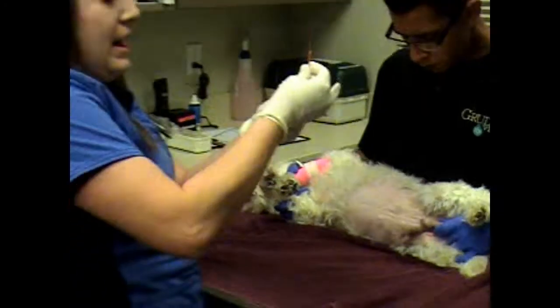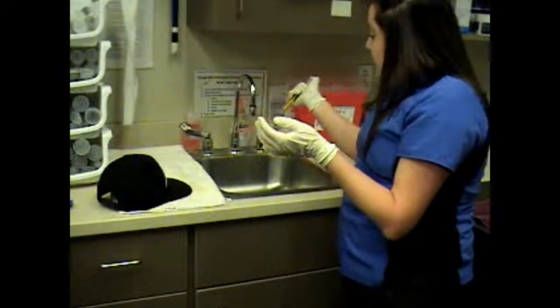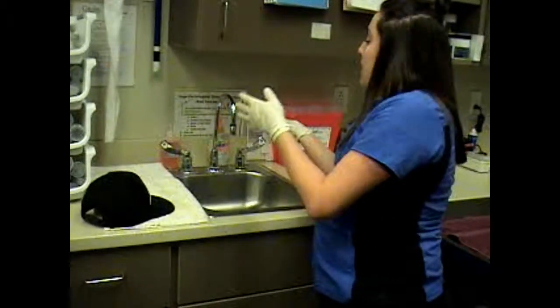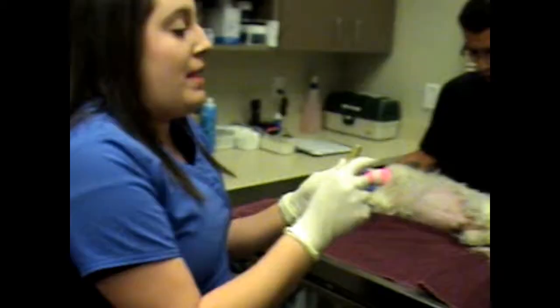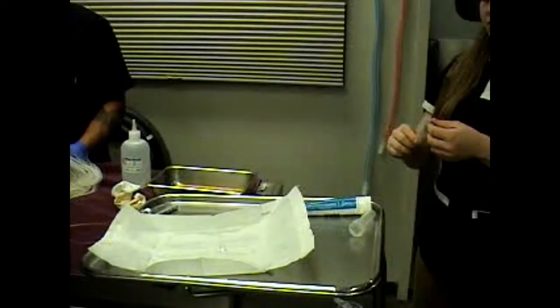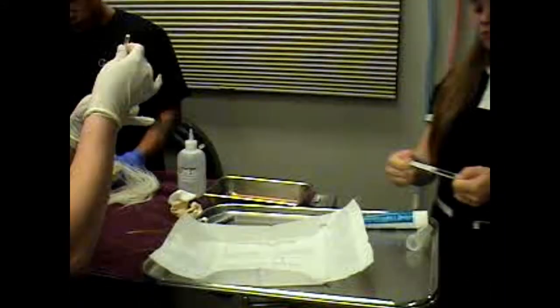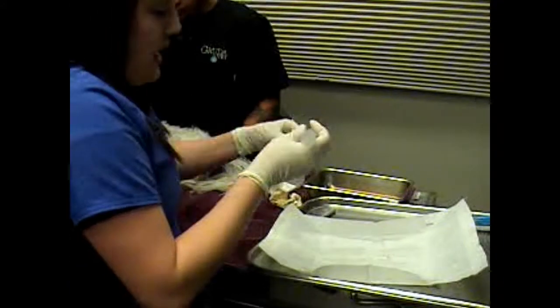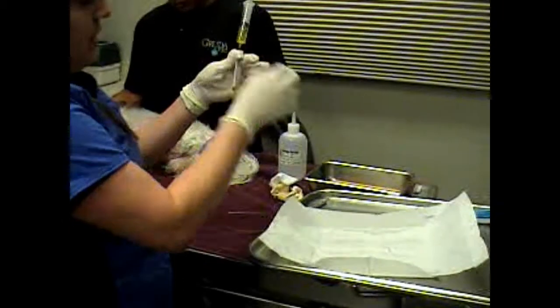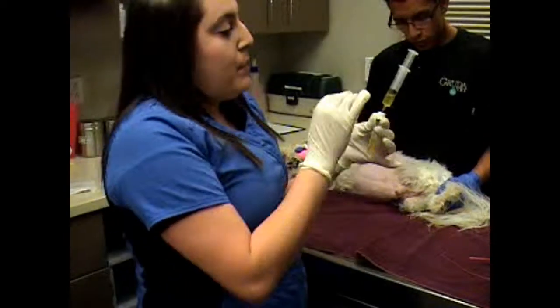So once I've got that, I'm just going to place my catheter. I'm going to discard the first 5 to 6 cc's just so that if there was any bacterial contamination, that's gone and away. If you'll open that 22 gauge needle for me sterilely, and then I'm going to stick the brand new 22 gauge needle onto this syringe. Thank you. And now I can just grab my Vacutainer, stick that in, let it suck all the urine in there, and now I have a completely sterile sample of urine.